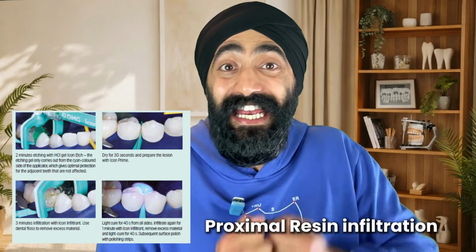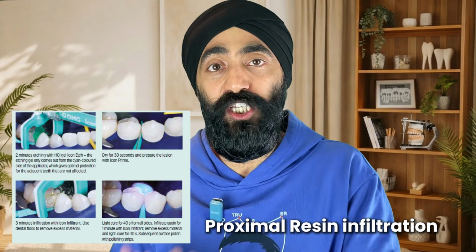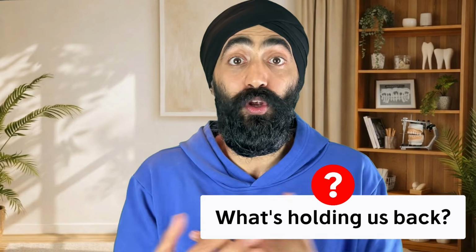There we have it, guys. Now we know that proximal resin infiltration isn't just a fad. It's not just a fiddly gimmick. We should be offering this to our patients. What's holding us back? What's been holding me back all this time? I don't have the training. Even though I can do the most intricate class 2, I've just never used the kit before. I'm one of those guys that just wants to be shown how to do it once or twice before I do it myself. And that's kind of held me back.